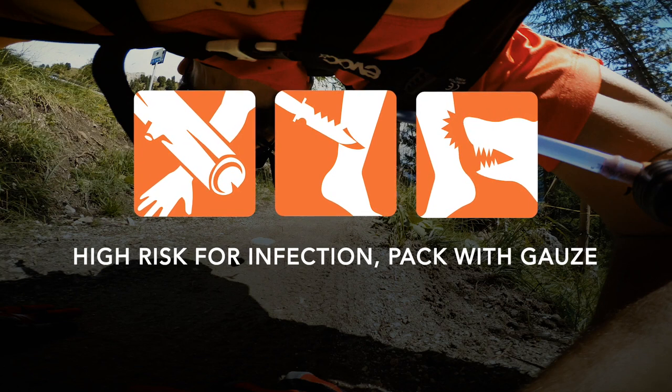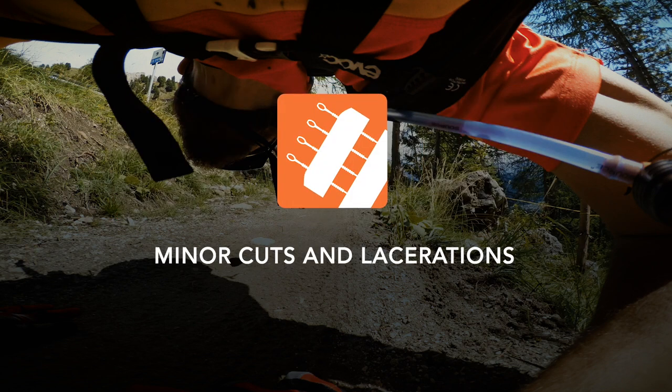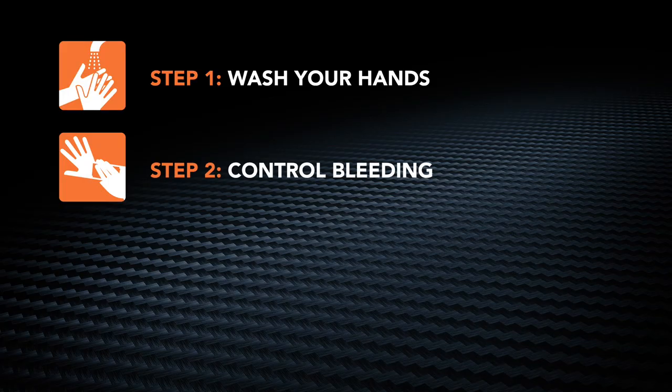In these cases, packing the wound with gauze instead of closing may be a better choice. Zip Stitch may be used on minor cuts and lacerations. Clean your hands with soap and water or antiseptic wipes, and control bleeding by applying firm direct pressure to the wound. Bleeding must be controlled before the wound can be treated.